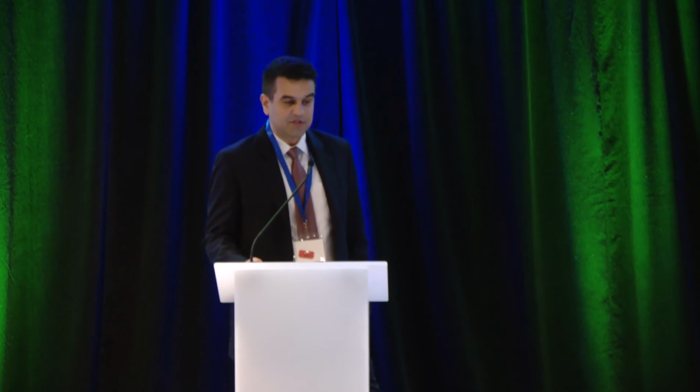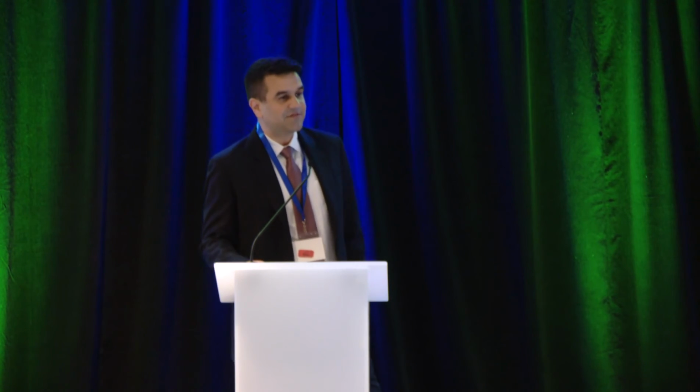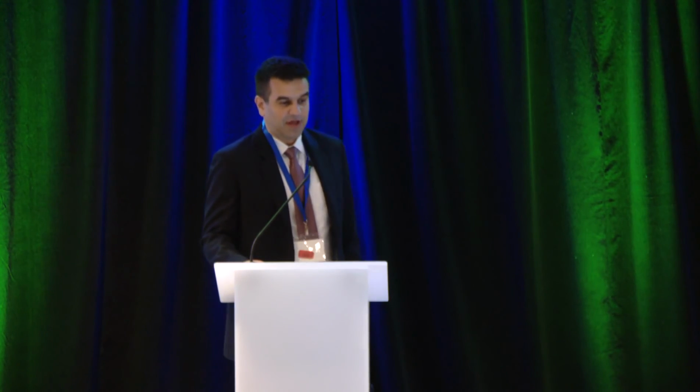And type 3, that's when you have premature swallows, at least 20%, where that distal latency is less than 4.5 seconds. And importantly, with the Chicago 4.0, you do not have any peristalsis overall. Now, if you do a lot of this, you will end up in a situation where you end up with a diagnosis of inconclusive achalasia.